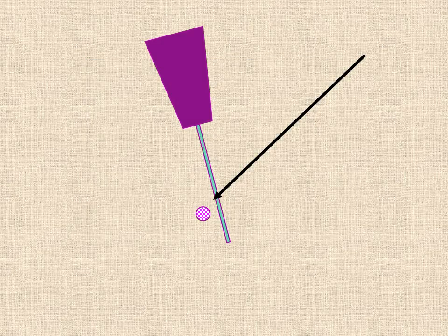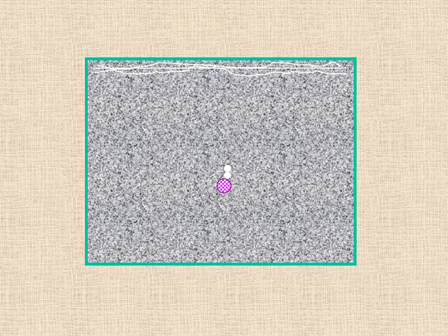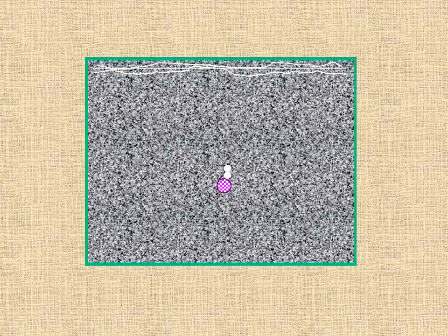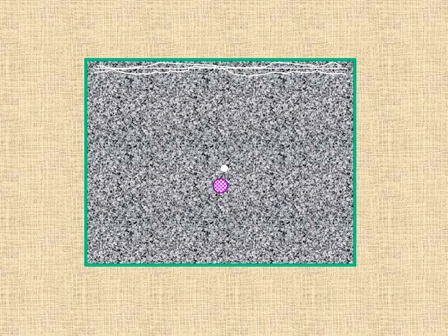Until eventually we get close enough to the nerve so that we can now see the double dot or bevel, in close proximity to the nerve. In order to do this, steeper approaches are better than flatter approaches because you have more of the needle within the very narrow beam. If we go past the nerve, we will see both the nerve and the very small dot within the picture. This is not very helpful because we have no idea where the tip is. All we can tell is that the shaft is going somewhere past the nerve.